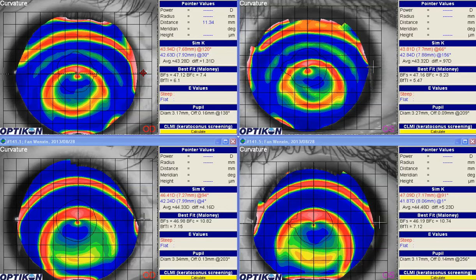This is an orthokeratology case where the initial set of lenses was decentering inferiorly. Some changes were made to flatten the lens, decrease the OZ, and increase the diameter of the lens, but it really is not riding up any higher than before. And the patient's complaint is glare, halos at nighttime.